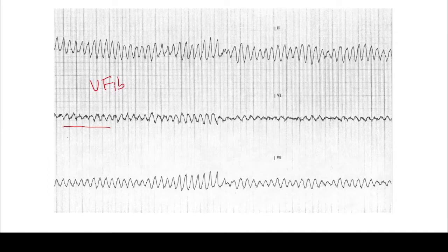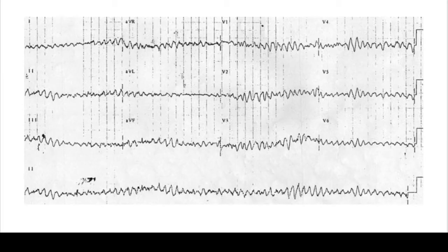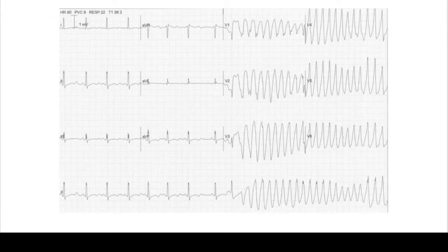Here's another example of V-fib. And then here we actually see a normal sinus rhythm degenerate into torsades de pointe — you see this kind of wide complex irregular tachycardia.